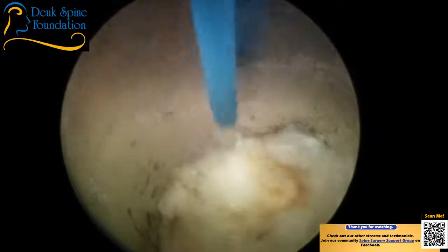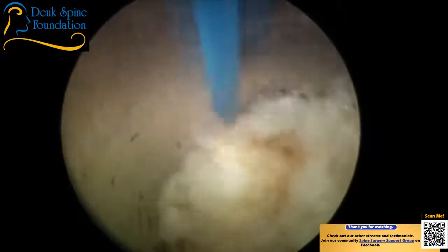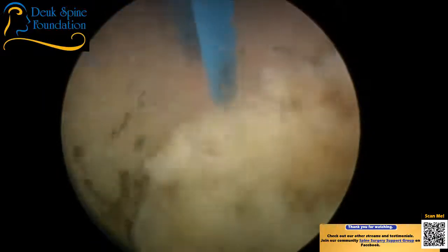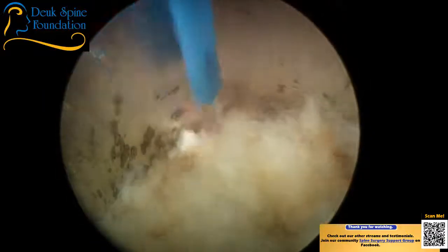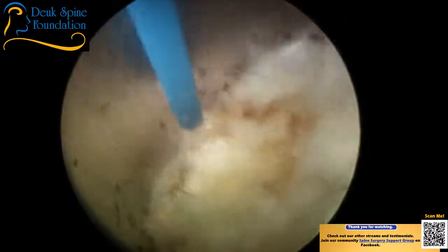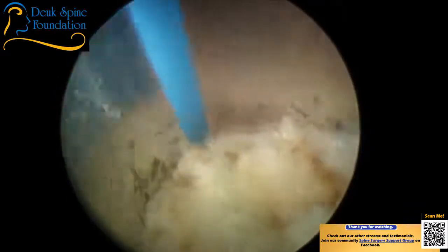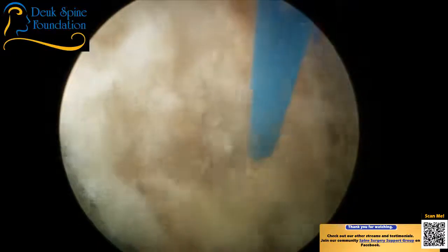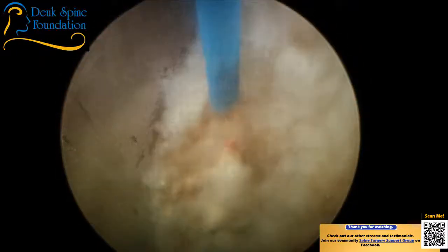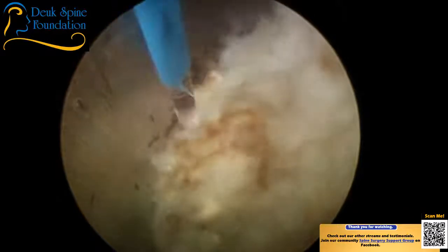All right, this is all scar tissue. This is a piece of herniation just scarred in there. What I was getting at earlier is there's scar tissue here in the disc when there shouldn't be, and it's because there's a tremendous amount of inflammation in the disc. This patient's had back pain for a long time. And like I said, he's got fractures that have already been dealt with by kyphoplasty, not by me.